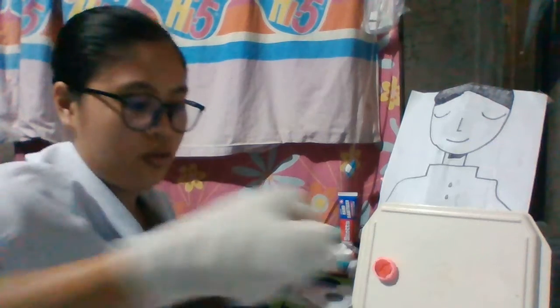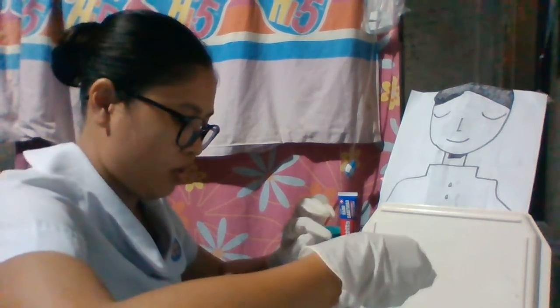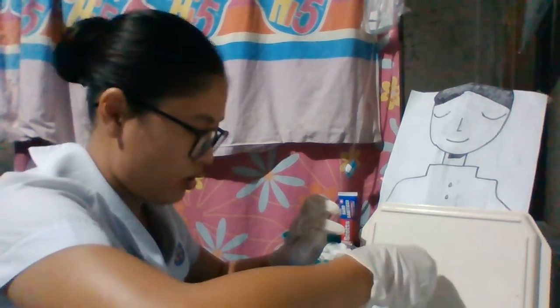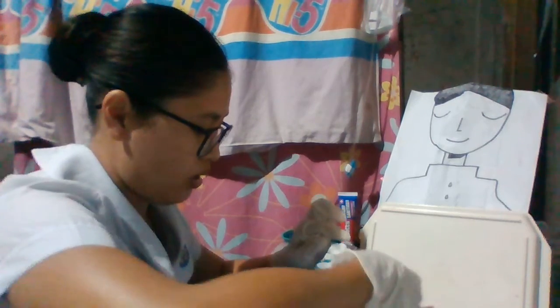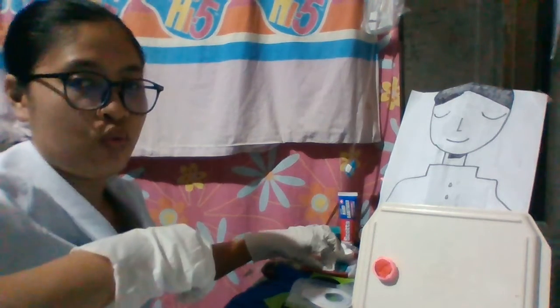After cleansing it with soap and water, we're going to remove all secretions from the skin using gauze or toilet tissue or a gauze pad.